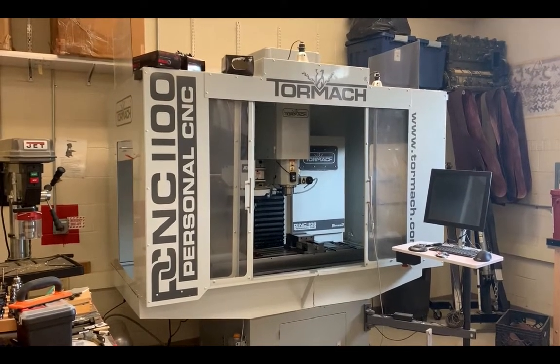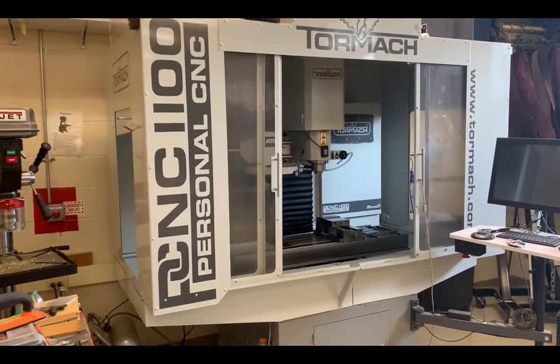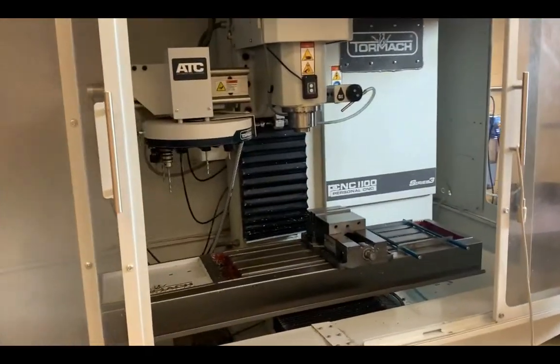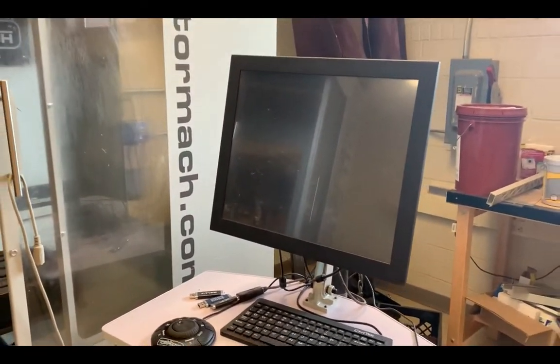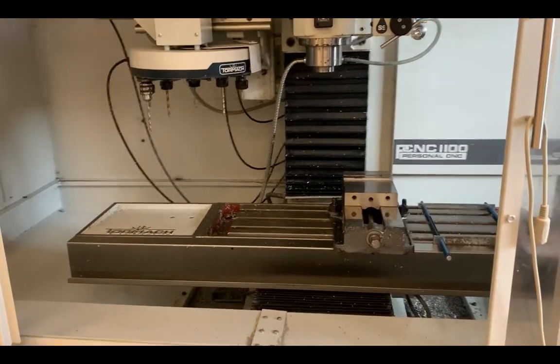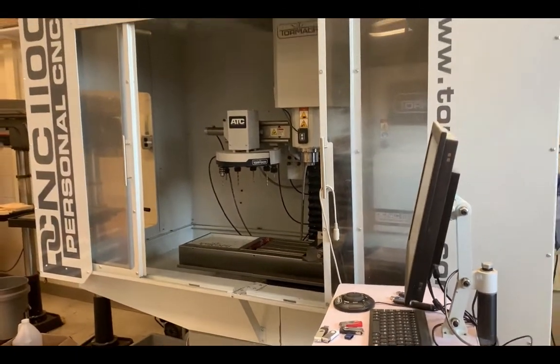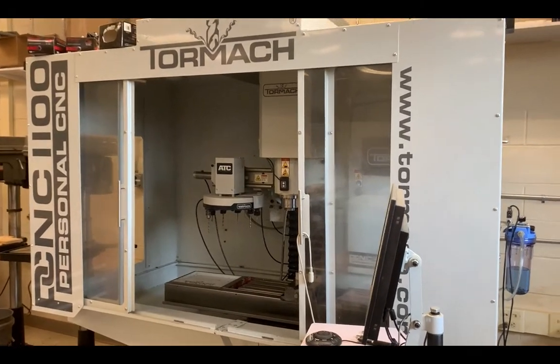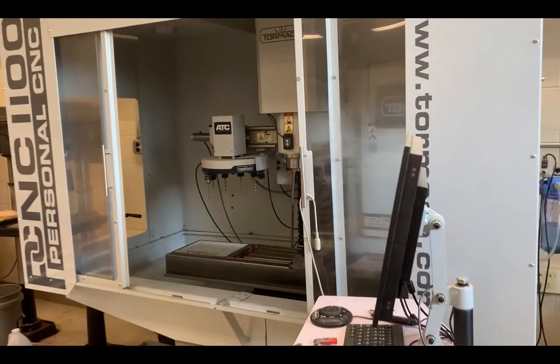This machine is in our shop downstairs. It is a Tormach 1100. It's a CNC machine. It just means that we could put metal in there, whether it's aluminum, steel, or titanium, and we could mill out any part that we can design in CAD and CAM on a computer. This led us to start to think that maybe soon we could start teaching the kids, or more kids, I should say, how to use this machine and design maybe prosthetic legs that can bear a lot of weight and stresses.